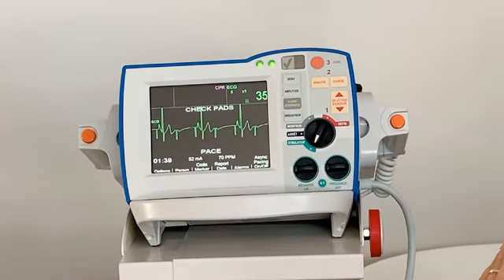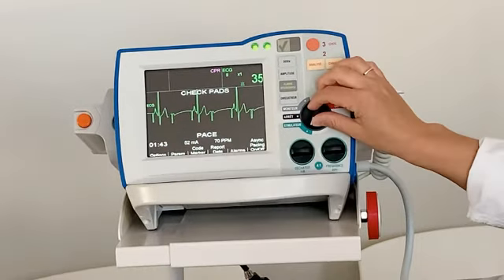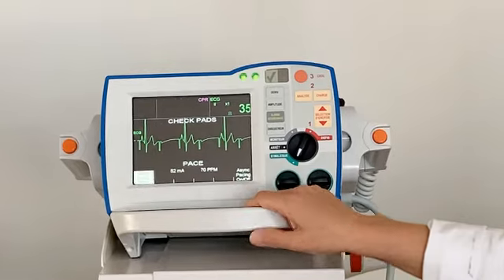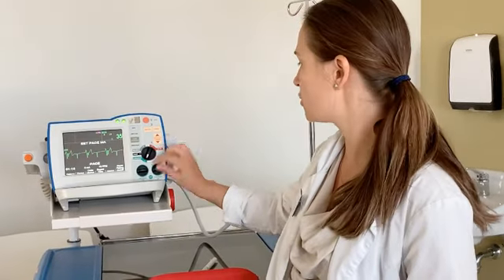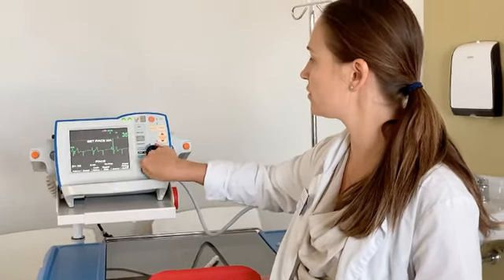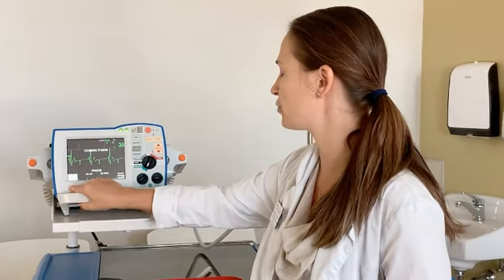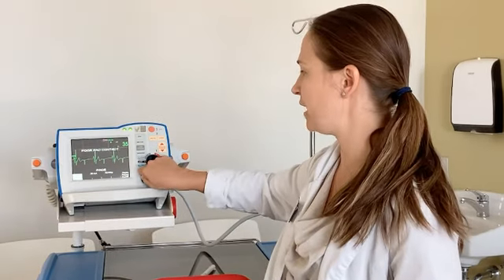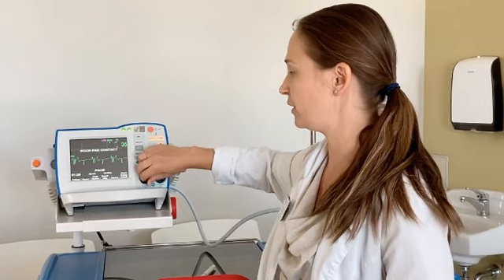Capture is when a discharge from the defibrillator corresponds with a heartbeat that follows it. Now I'm going to set the current at which I will stimulate my patient. In general, I will start at about 50 milliamperes. I will set it at 50 milliamperes to start, and I will see if I have electrical capture.